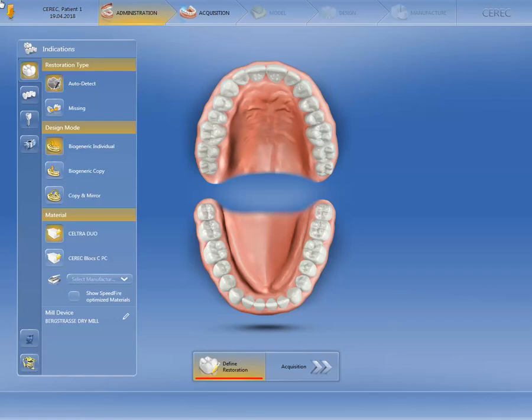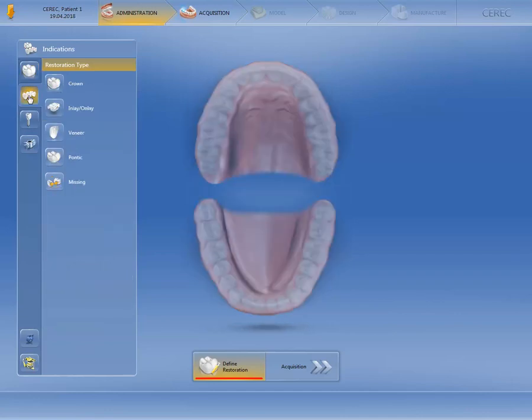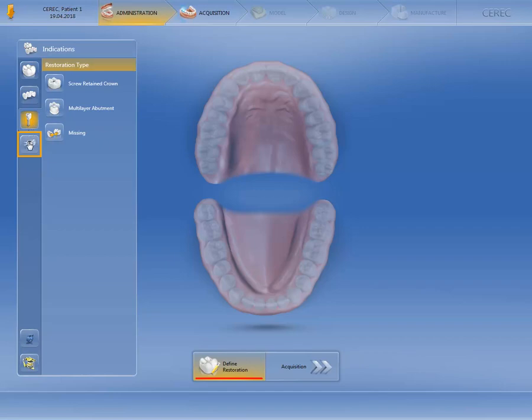In this phase, we first of all determine our indication. You can choose between a single tooth restoration, a bridge restoration, a restoration on an implant, or the indication CEREC guide.